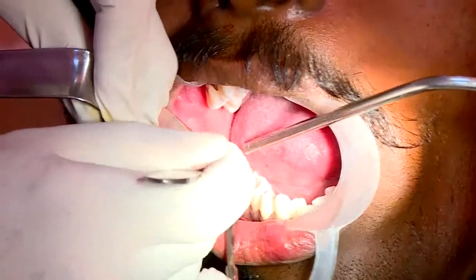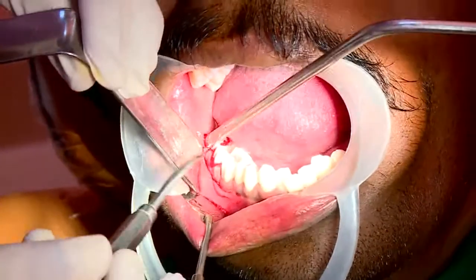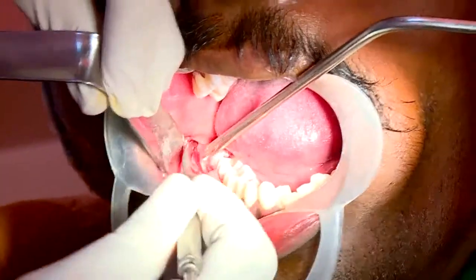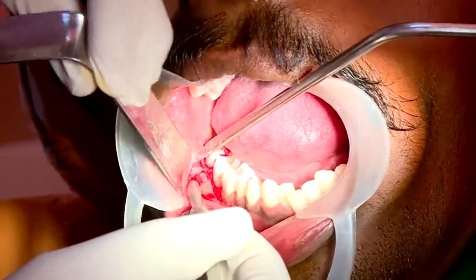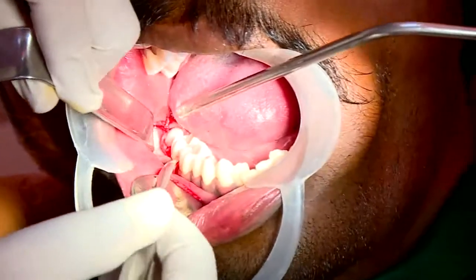So, make sure that the flap is a full thickness flap and you reflect the periosteum as well. That will prevent bleeding. If you can see clear bone like this, you will see that there is very little bleeding.